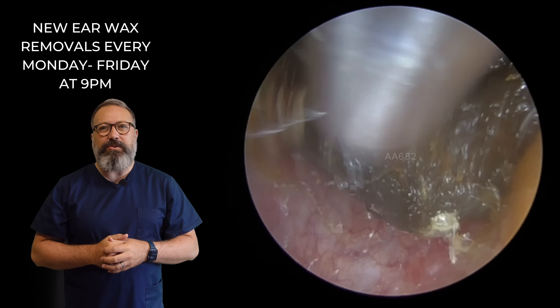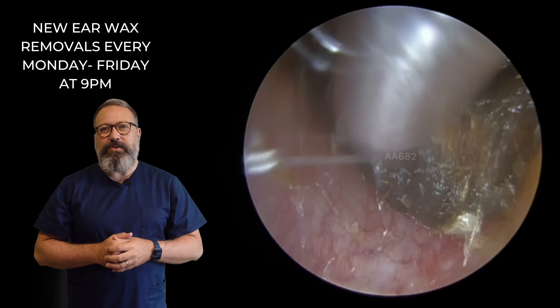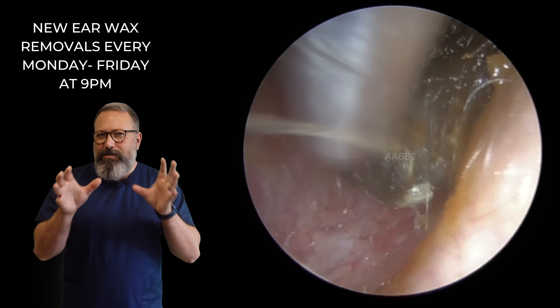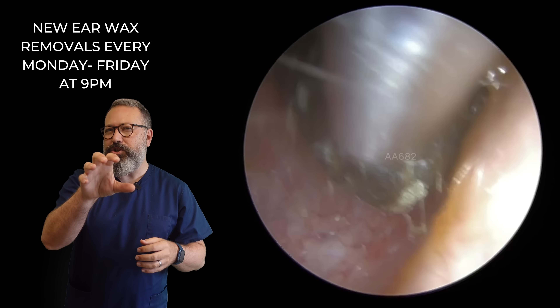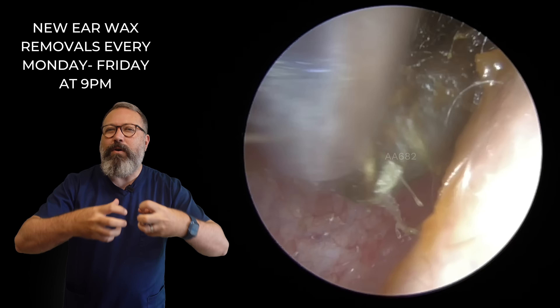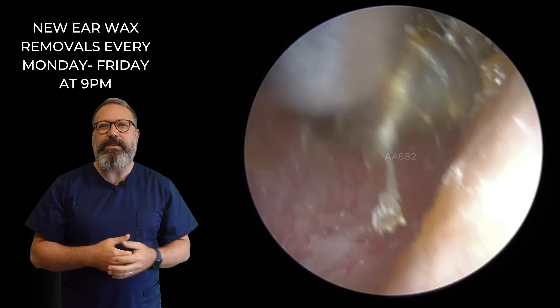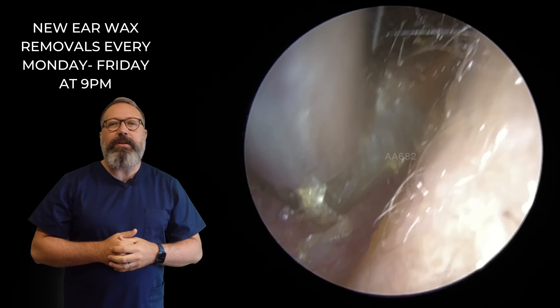Let's see if we can drop on this one edge with a little bit of olive oil there — just coated the camera unfortunately. But we're just going to give this a little bit of a wiggle. We need to dislodge this from the side of the canal wall, just unstick it — just holding the suction tube in place, letting the suction power build. So it only goes up to a certain amount, but it will really hold nice and tightly then, especially with a softer wax — it sort of beds into the wax a little bit and then we're pulling this forwards now.